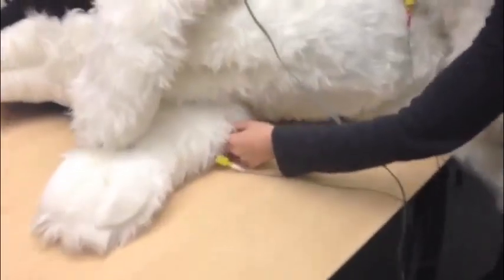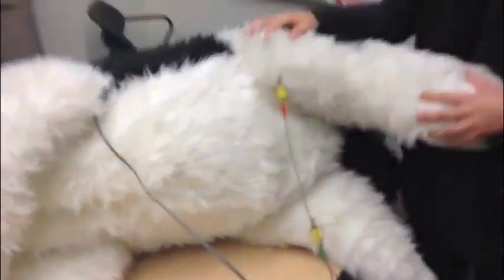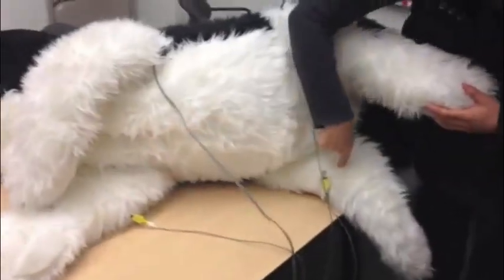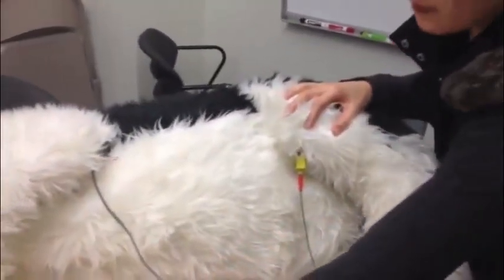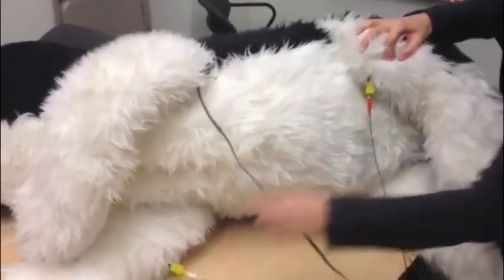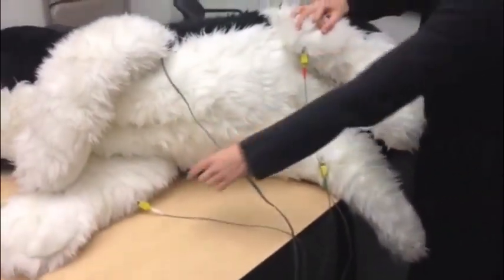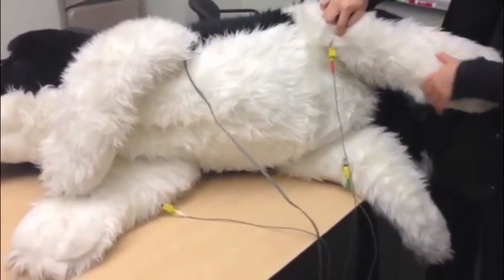And you just take it and clip it on. And then you place the other lead. So the way to remember it is snow over grass and smoke over fire. From white to the black lead, that represents lead 1. From white to the red lead, that represents lead 2. And then from black to red, that represents lead 3.